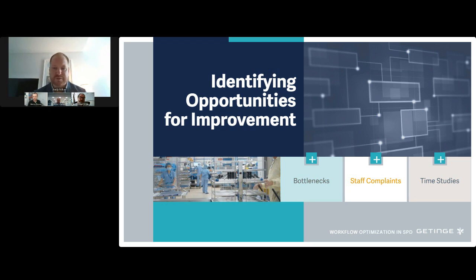You've got one person at the sink, no washers are going, and there's 5 people in assembly waiting for that set to come through. So it's shifting your staffing. Okay, let's send 2 more people into decontam, 1 person to start breaking down those case carts, 2 people to start pushing through the washer, and now you're actually moving, right? And that's setting the tone for the entire day. That downstream effect is tremendous.